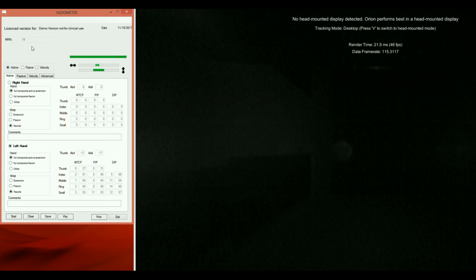Once you have it, you're going to find a couple of things here. Obviously, you're going to have the date of the exam and the patient's information. Over here in this area, you would also have more patient health information if you wanted to. Right now it's blocked, but you can have that. In this bar right here, you're going to have the timer once you do the exam. It lasts a few seconds. That can be changed also, depending on the settings that you want to use.